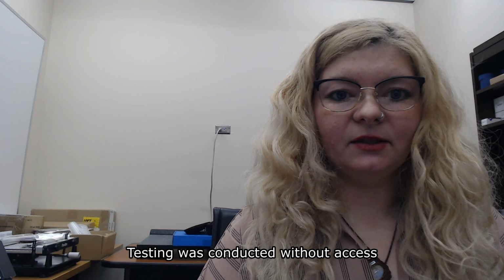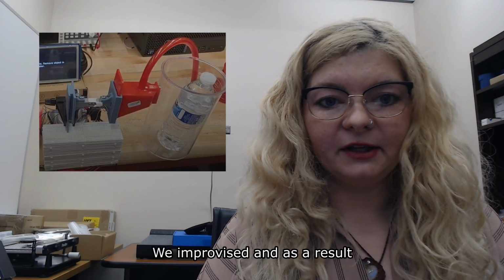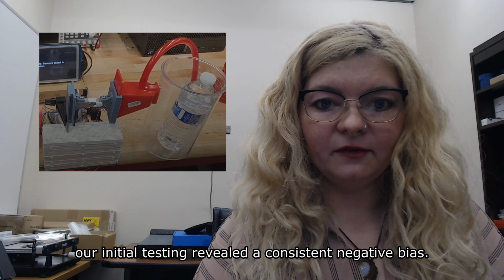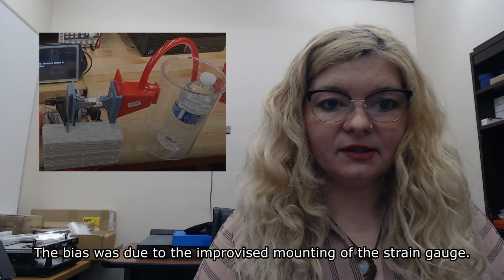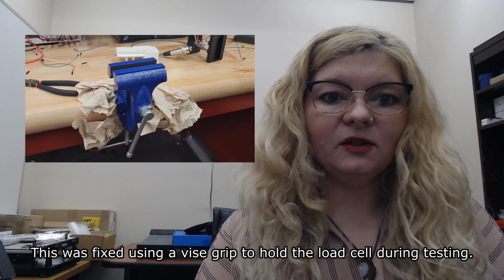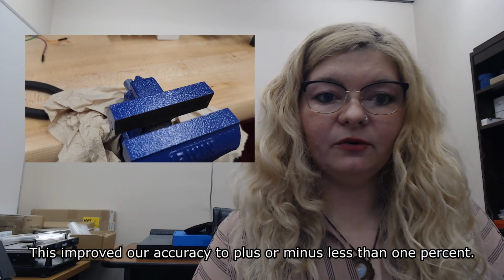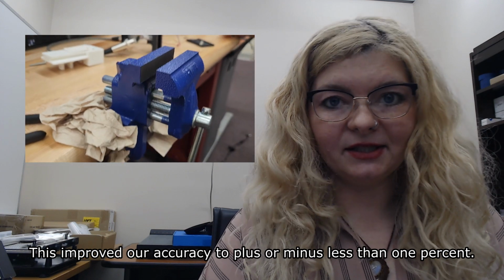Testing was conducted without access to the medical rail the device will attach to. We improvised, and as a result, our initial testing revealed a consistent negative bias. The bias was due to the improvised mounting of the strain gauge. This was fixed using a vice grip to hold the load cell during testing. This improved our accuracy to plus or minus less than 1%.